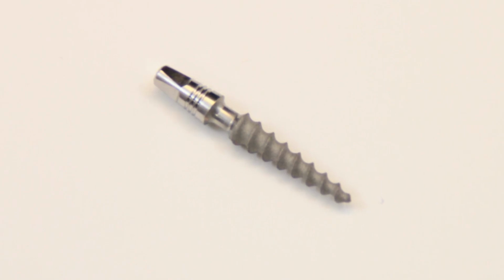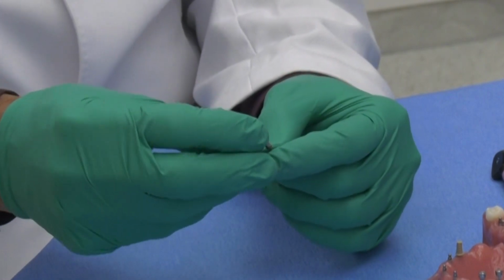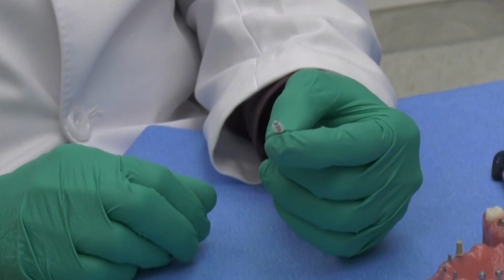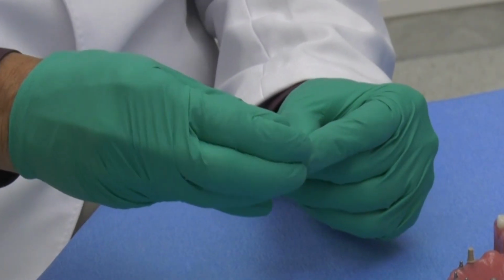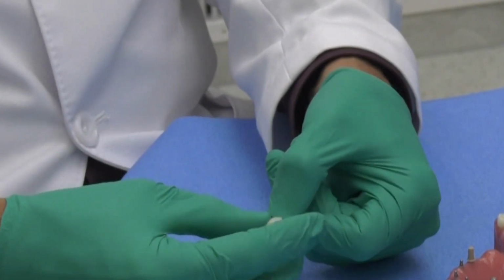In addition, I'd like to show you how to temporize over the new mono implants. With the mono implant, you have this nice abutment, very similar to the TrueLock abutment, but it's obviously in titanium. What we do with temporizing the monos is we use the same OP shim, the larger shim, we place it over the top of the mono abutment after the implant is placed, and then we take a ball of composite, same as we did with the TrueLock, and pancake it over the top, buccal lingually, of the shim in the place of where the tooth is, and we shape it like a tooth.